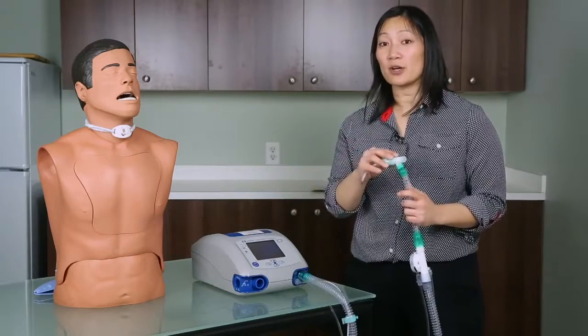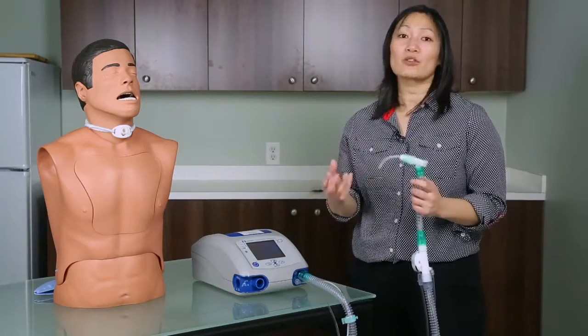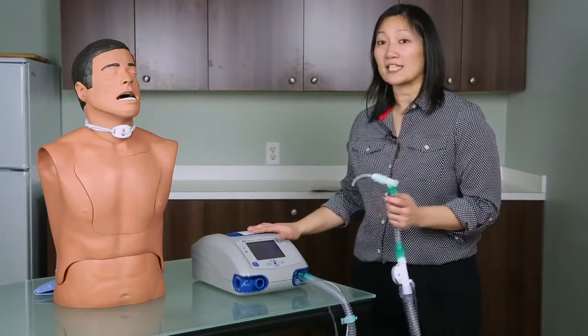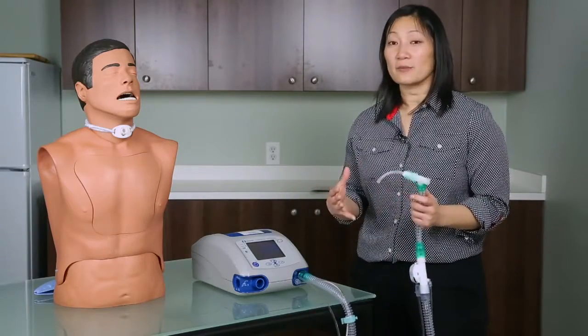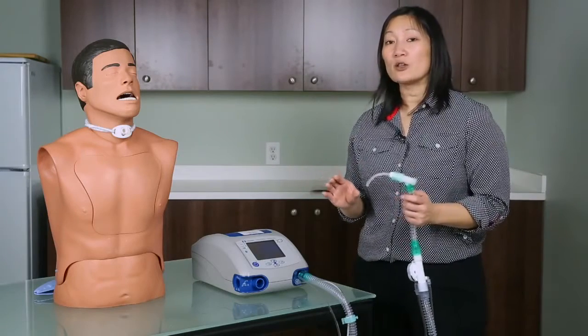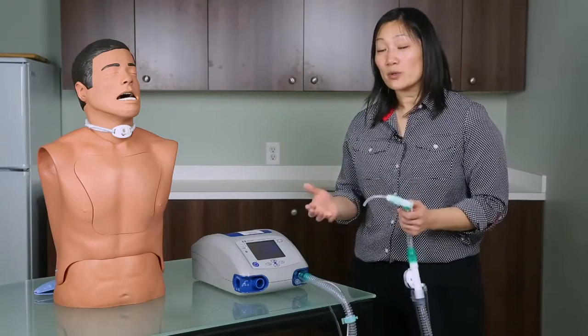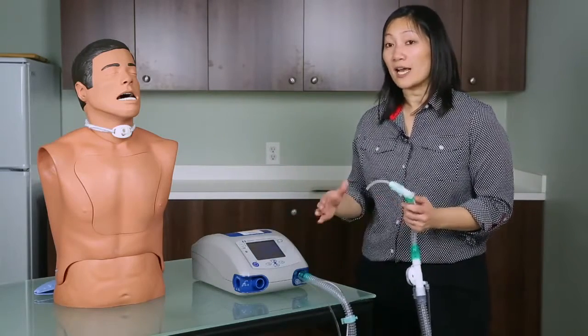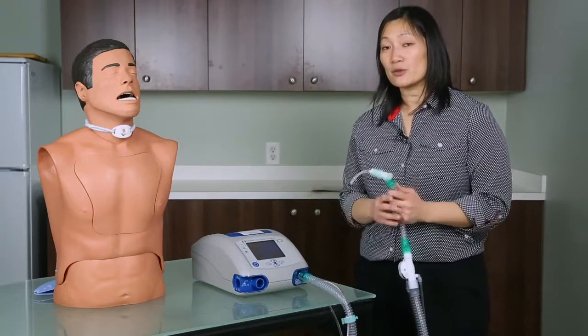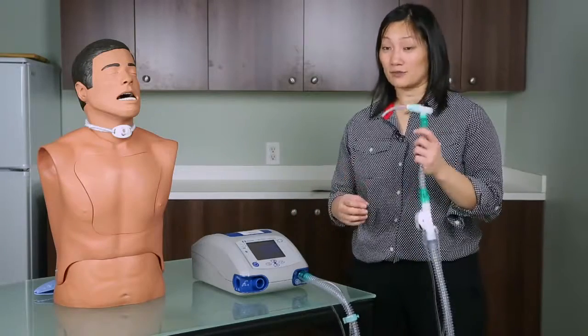Once you have the inner cannula, or your tracheostomy, attached to the distal part of your circuit, and you've simulated a dislodgement of the inner cannula or the tracheostomy, the ventilator should technically alarm. If it is not alarming a low pressure or patient disconnect, then you know that the low pressure alarm is inappropriately set. So we're going to go into the alarms menu and adjust the low pressure so that a patient disconnect alarm will occur with this simulated disconnection.